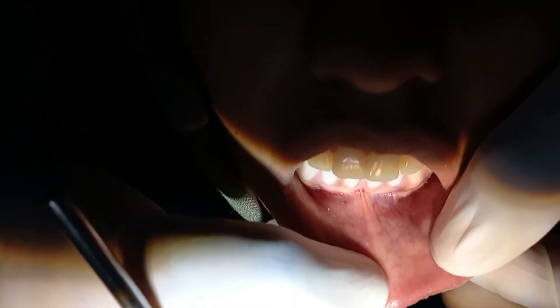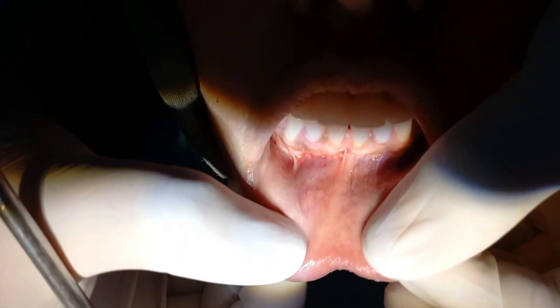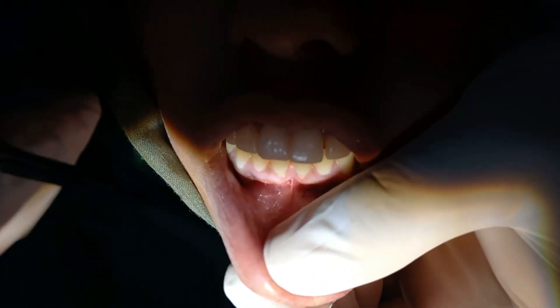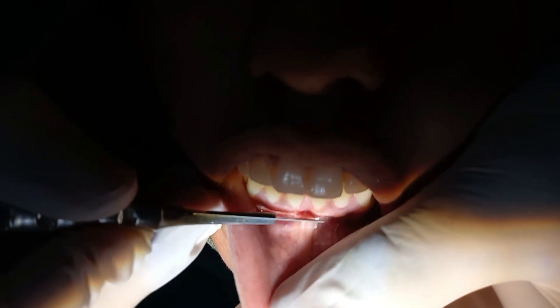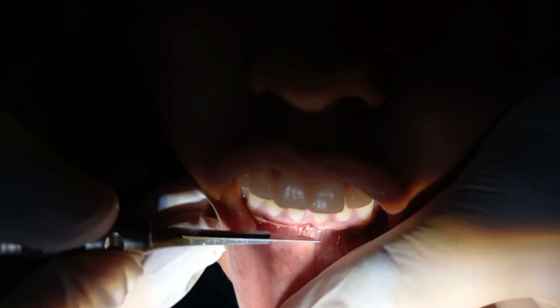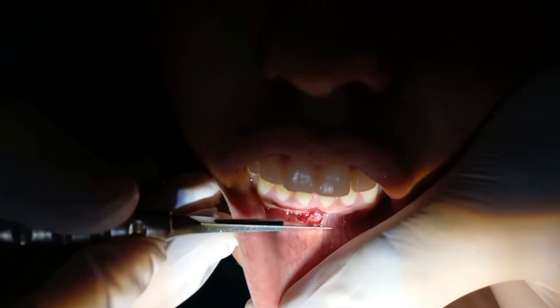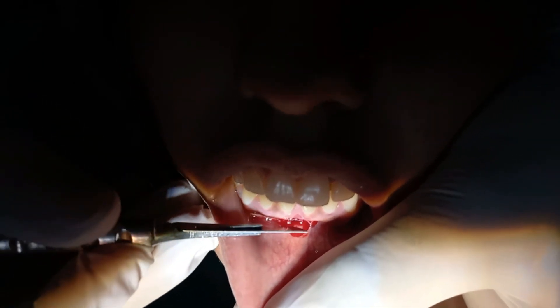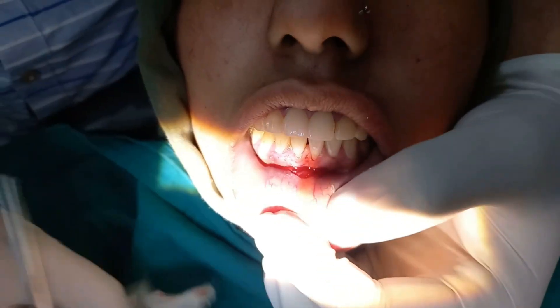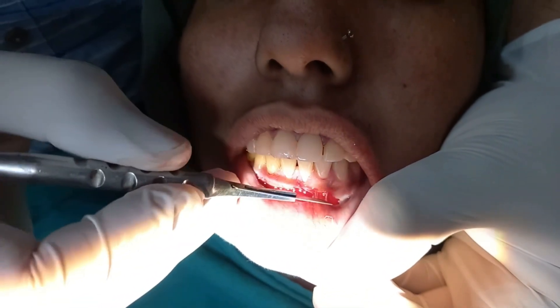Looking at an example of a high labial frenum — first we are going to anesthetize the area by infiltrating the local anesthetic solution. Then we hold the frenum with the hemostat, and with the number 15 blade, we place an incision over the connective tissue. A triangular resected portion of the frenum is removed, and the wound left after the incision is in a diamond shape.